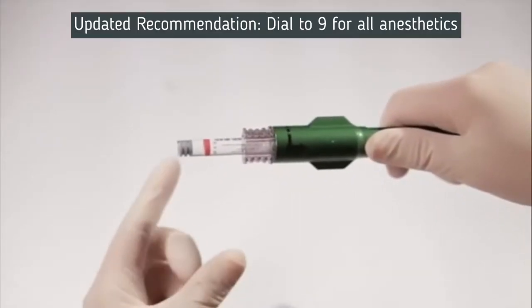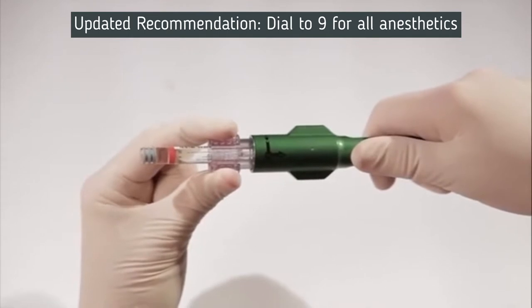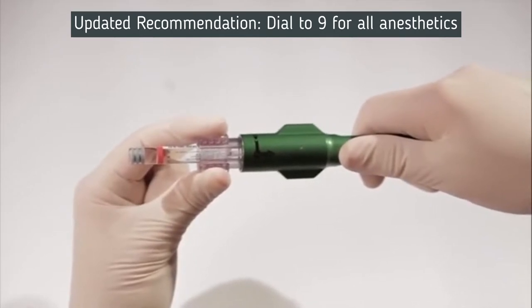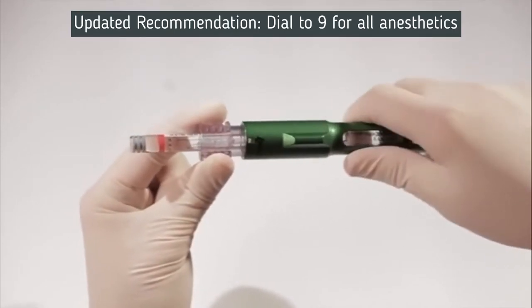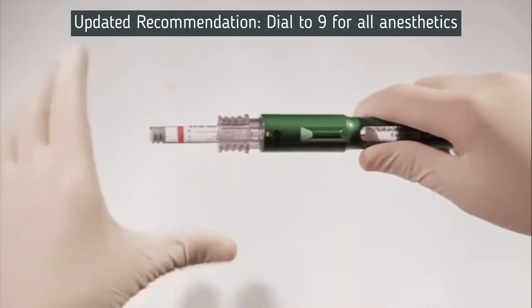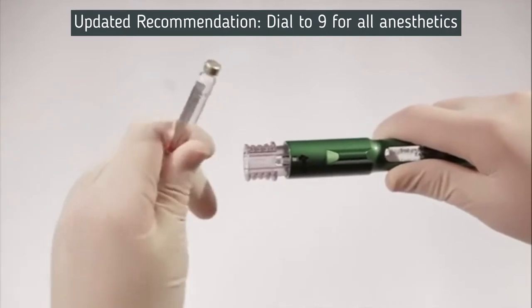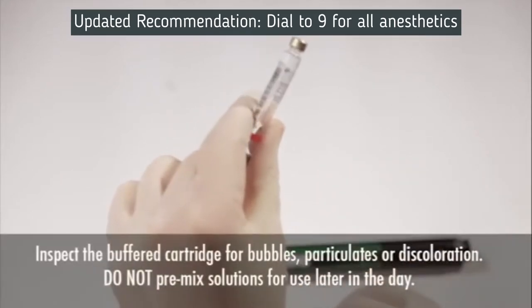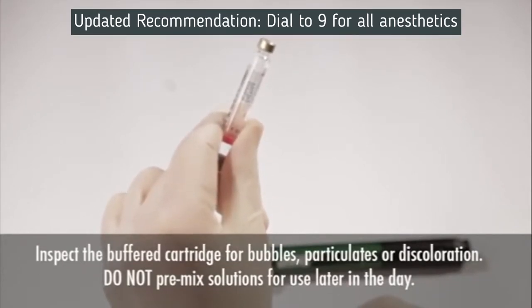To remove the 1.8-milliliter cartridge after mixing, first grasp the connector with your thumb and forefinger and pull straight out approximately one quarter inch to the number 2 position. Note that in the number 2 position, the 1.8-milliliter cartridge is still locked in the cartridge connector. Second, turn the connector counter-clockwise approximately one quarter turn back to the number 1 position. This unlocks the 1.8-milliliter cartridge from the connector. Grasp the 1.8-milliliter cartridge and pull it straight out. When the cartridge is ready to be used, inspect it to rule out bubbles, particulates, or discoloration. Do not premix solutions early in the day for later use.